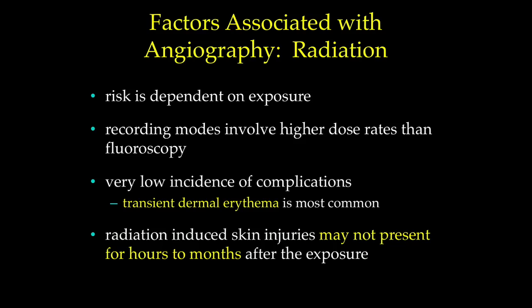Recording modes like Cine give much more radiation than just fluoroscopy, and that's why we do a lot of image saving rather than Cine these days. They might question you on this: the most common side effect of radiation is transient dermal erythema. Others are potential, but that's the most common. And in terms of timing, it might not present for hours or even months after the exposure.